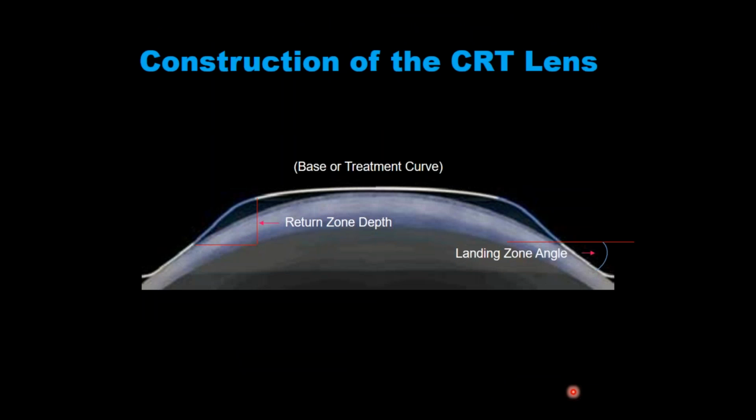Now consider that the CRT lens is built based on depth. You have the base curve of lens chosen in relationship to the refractive change that we wanted. So if we have a central radii of curvature of 43 diopters and we need about 3 diopters effect, then we're going to fit a base curve approximately 3 diopters flatter plus a small fudge factor, maybe 3/4 of a diopter.